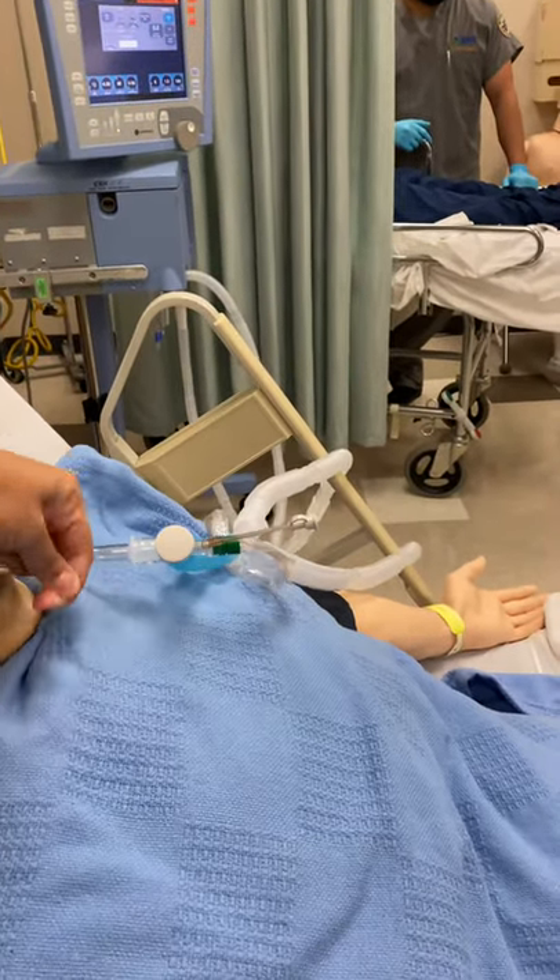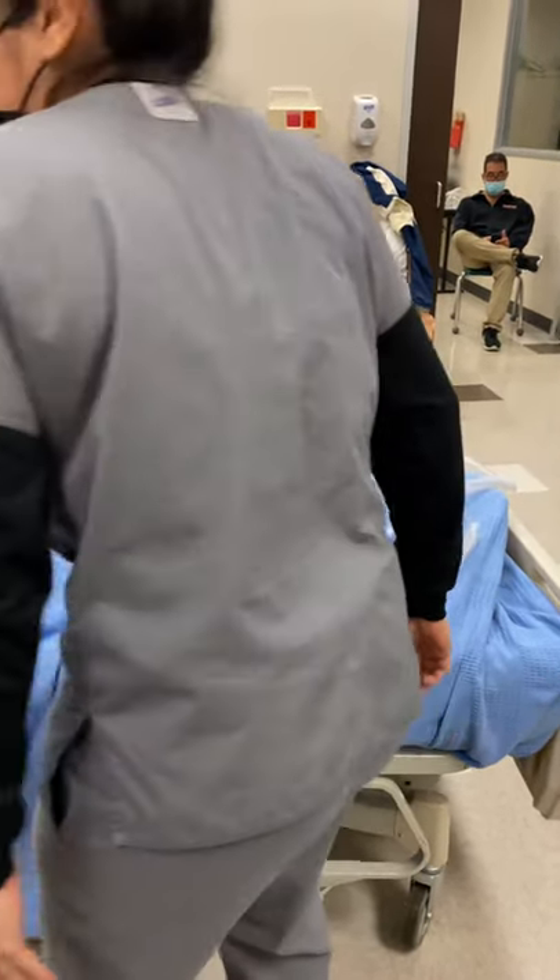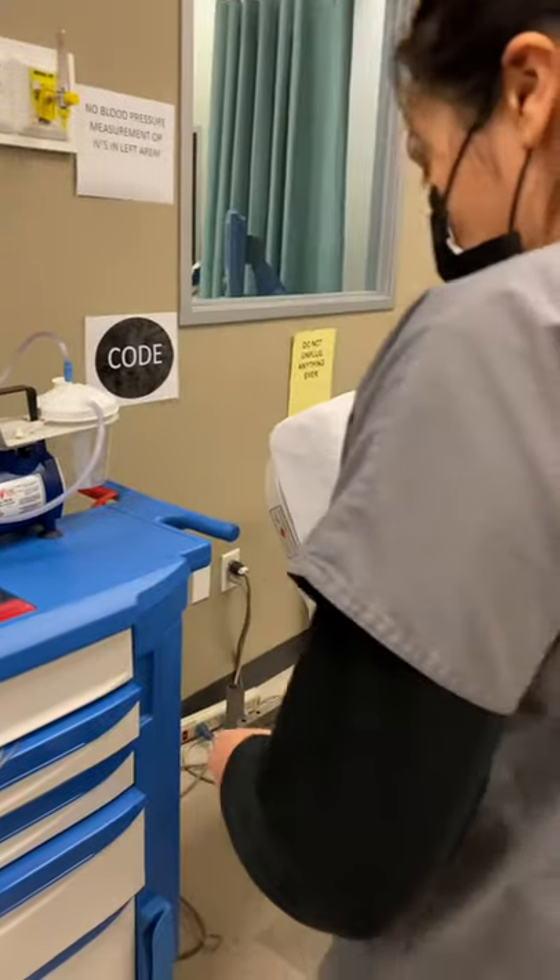The legs are going to be a little elevated. And then I'm going to go ahead and get my nasal cannula ready just here on the side.